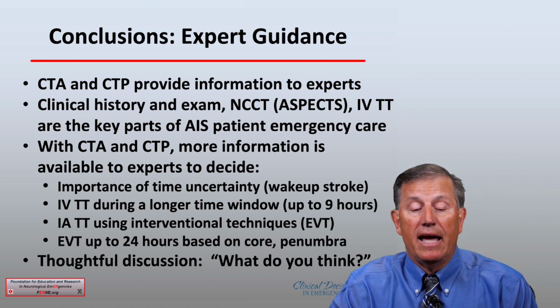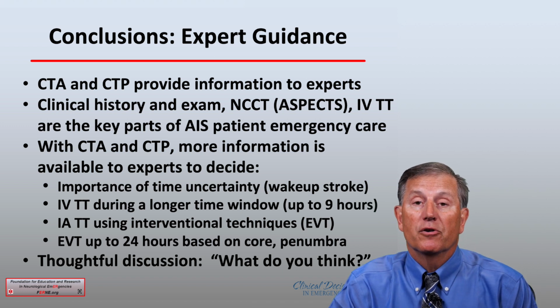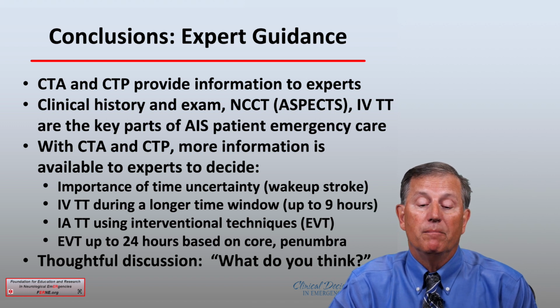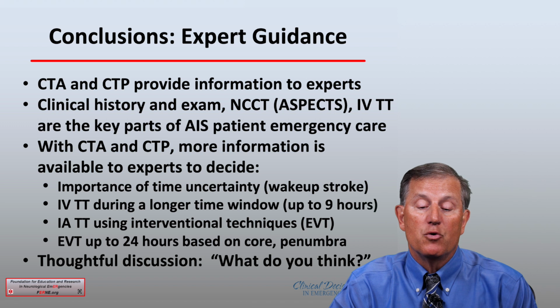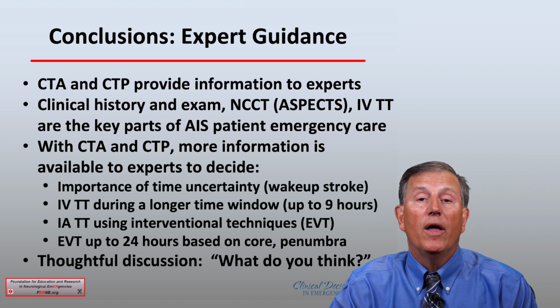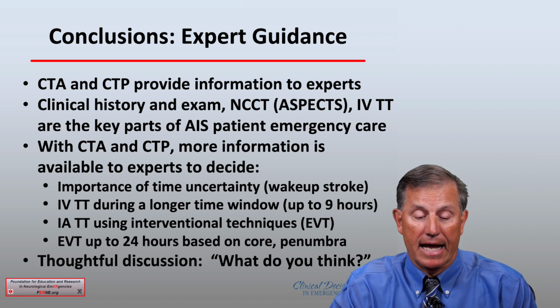We know that CTA and CTP do provide more information to the experts regarding time uncertainty, like with wake-up strokes, the possible use of IV thrombolytic therapy during a longer time window, such as up to 9 hours, the use of intra-arterial thrombolytic therapy using interventional techniques in EVT, and the use of EVT up to 24 hours based on the size of the core and penumbra, with the ability to remove stroke thrombus mechanically.